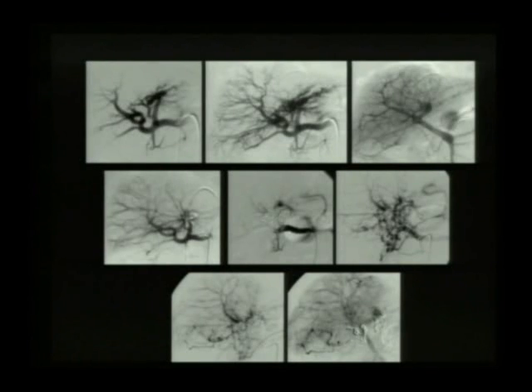So here's one more fistula, which is much more complex. It's not a single channel. There are hundreds of fistulae in this boy's liver. And this was his initial angiogram, done at an outside hospital on the opposite coast of Canada to Toronto. They thought that his malformation was in this somewhat dysplastic looking vascular arrangement here of the hepatic artery.